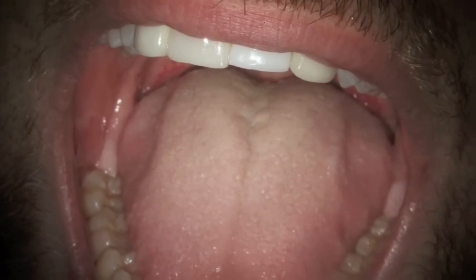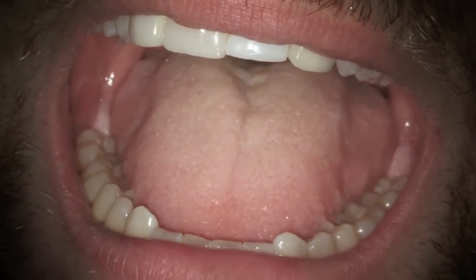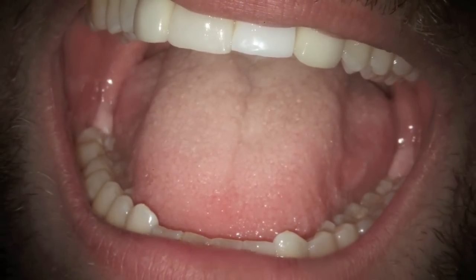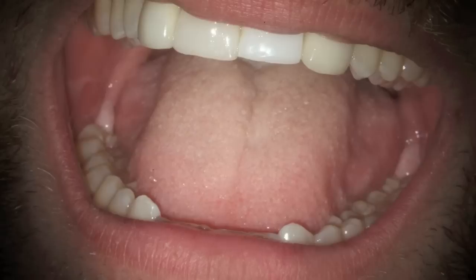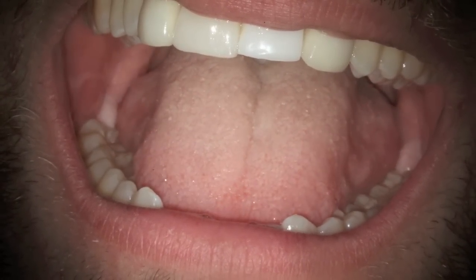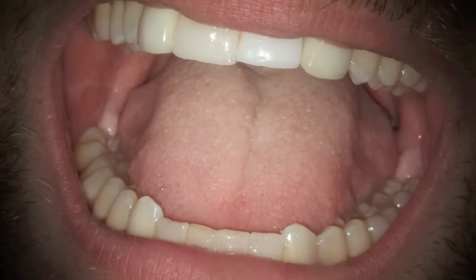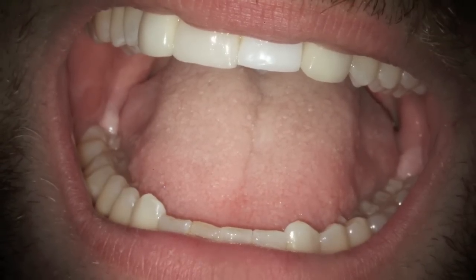A little bit later, you'll see the pictures we started taking, and every time we would take a picture, his tongue would be flapping over to the occlusal surfaces of the teeth. So that's one of the things that brought it to mind as far as to evaluate. You can see how the tongue is pushed up into the palatal area there, and we're still at the preliminary stage. Now there's a couple other things to look at.